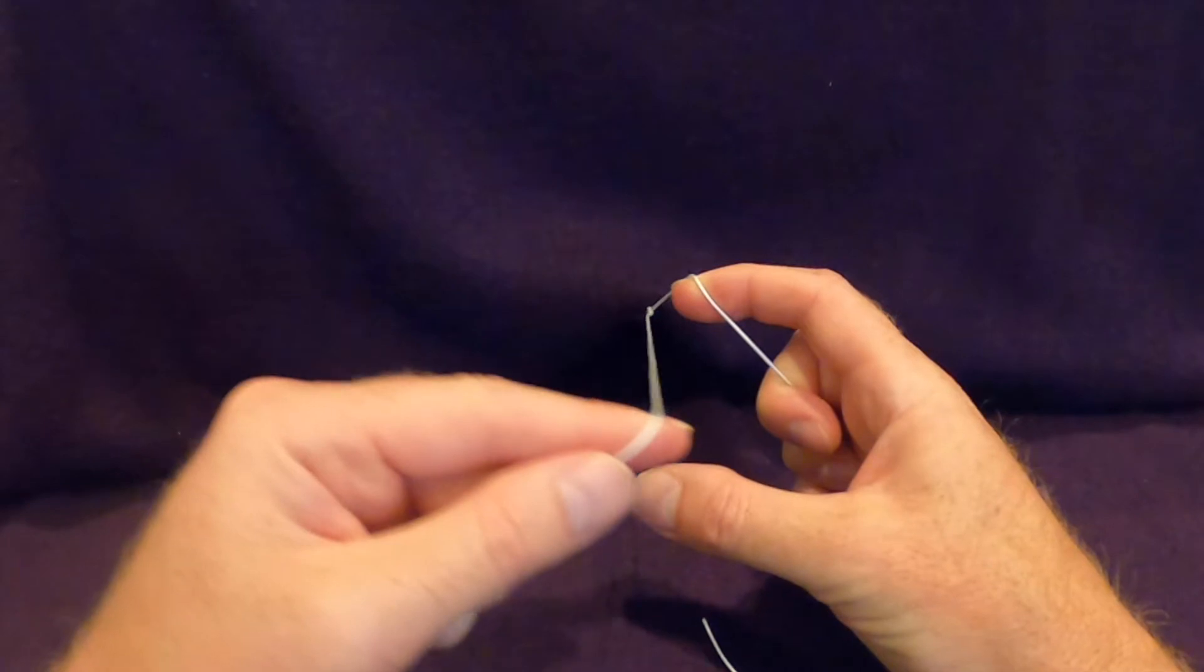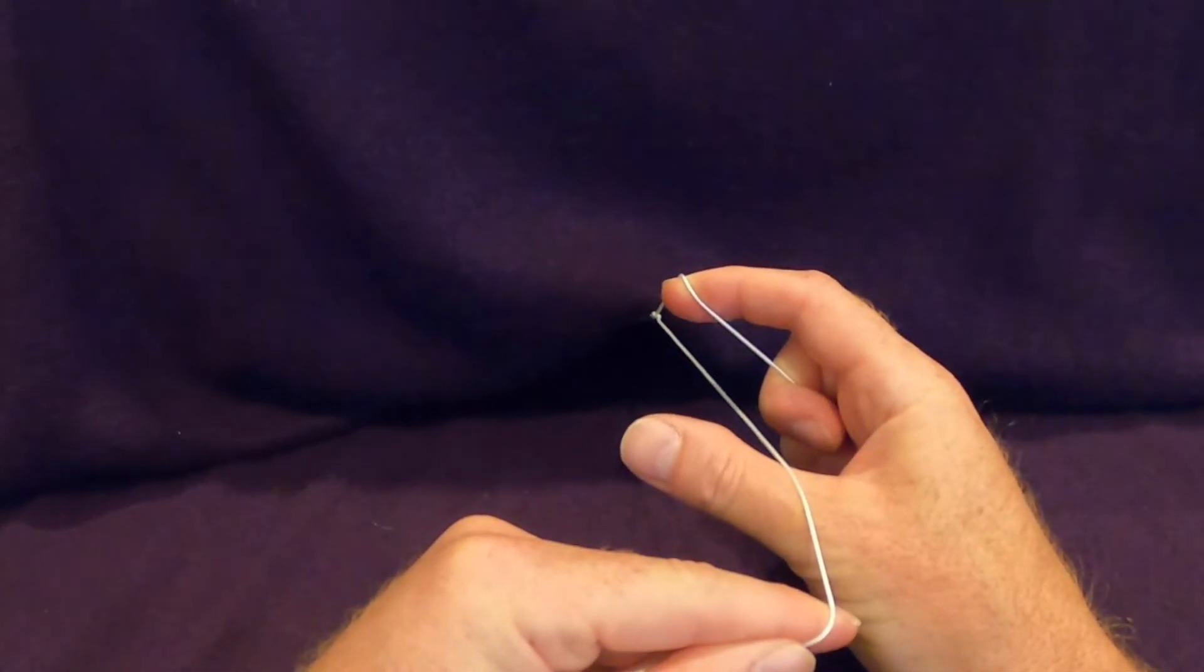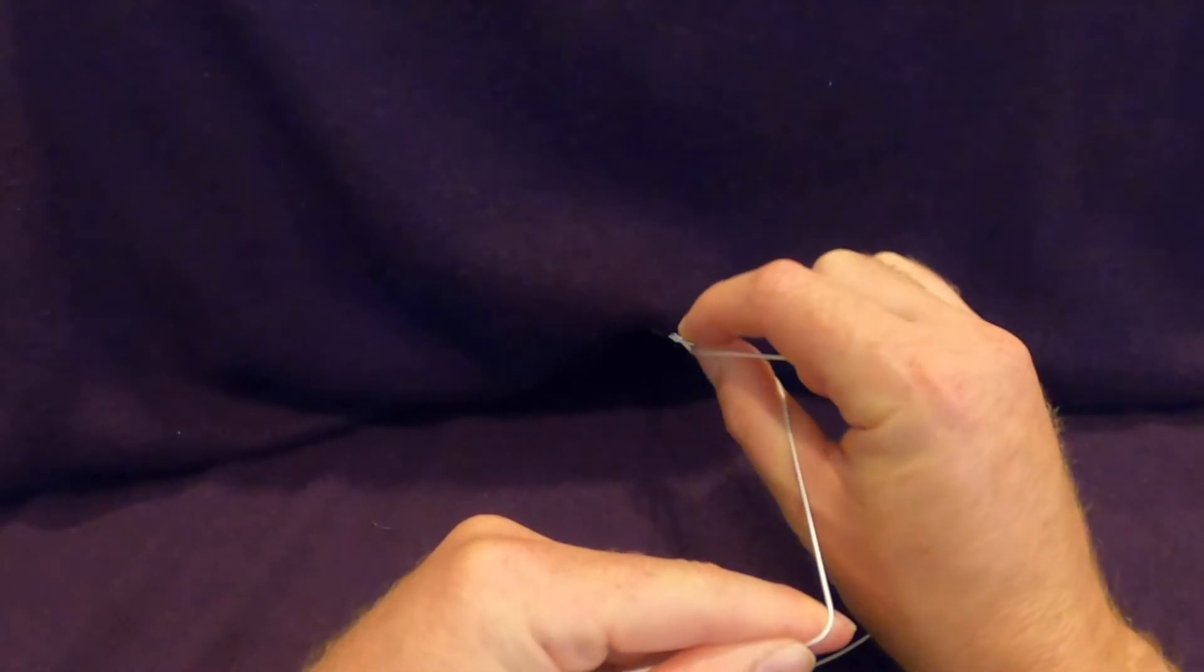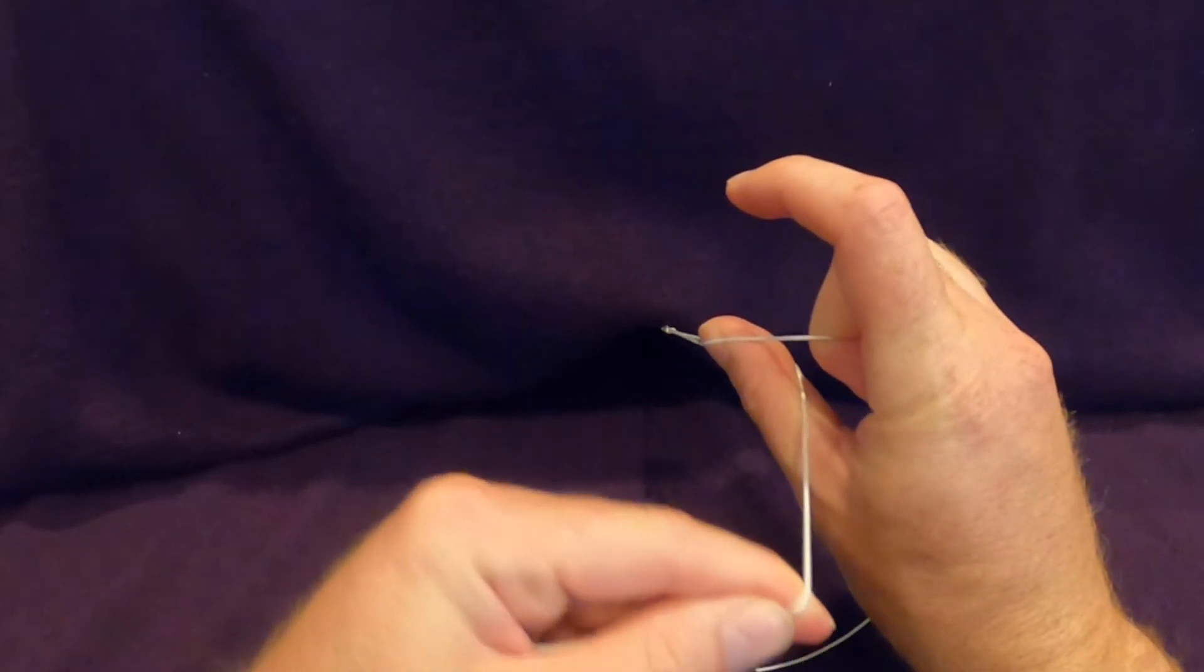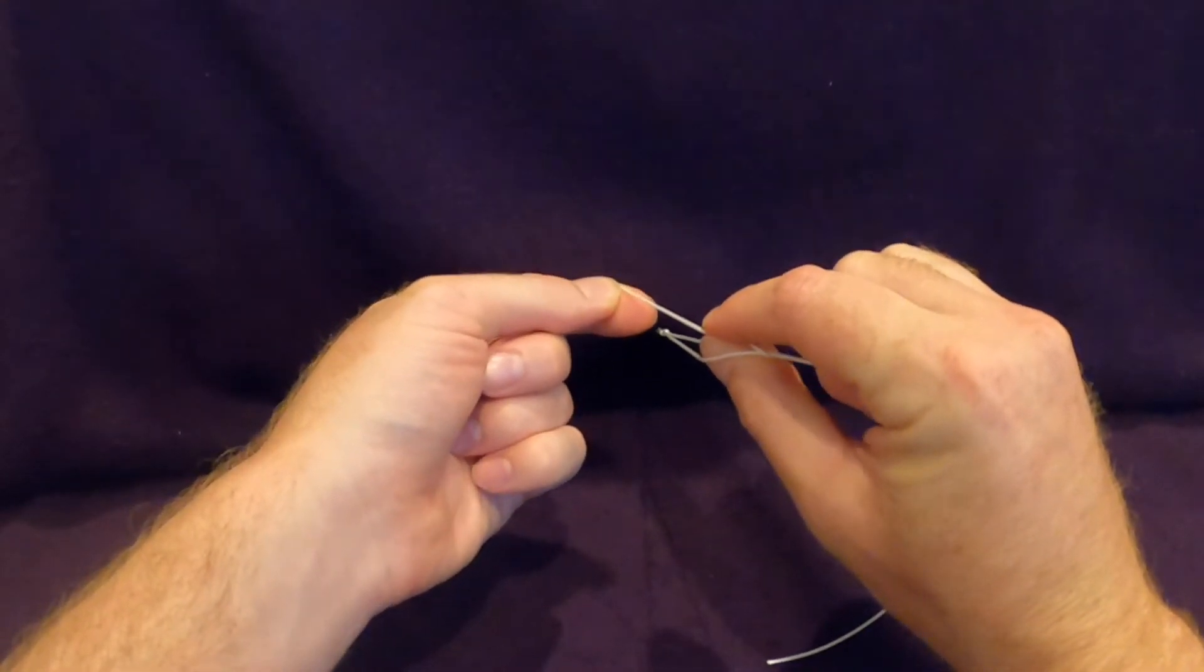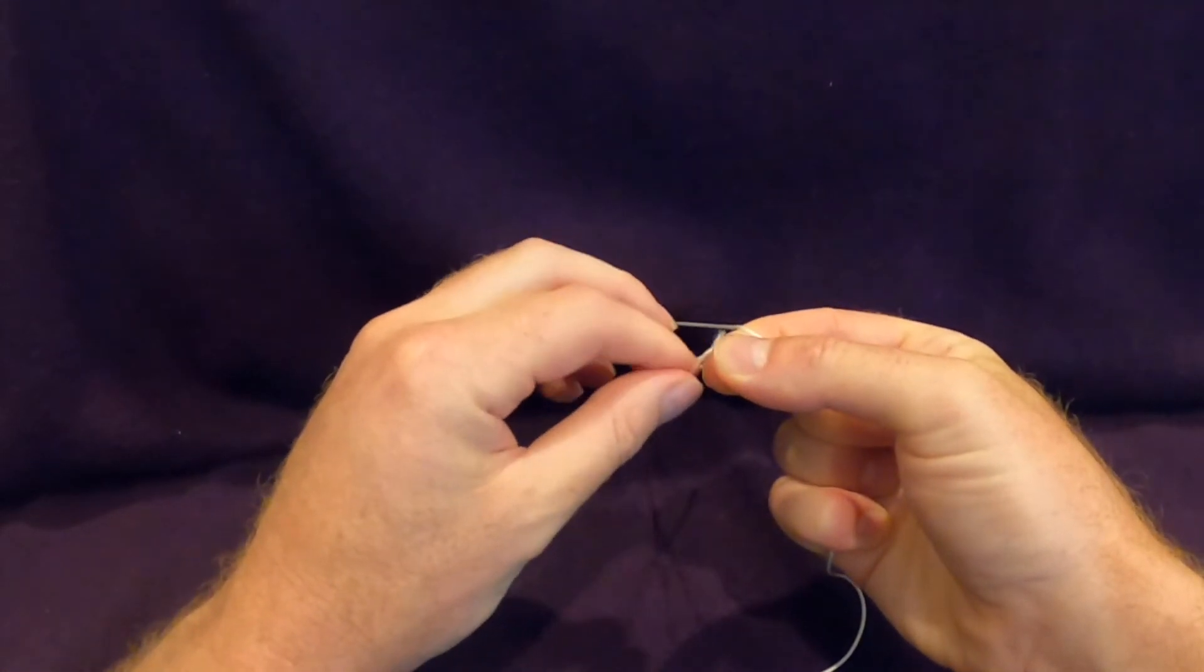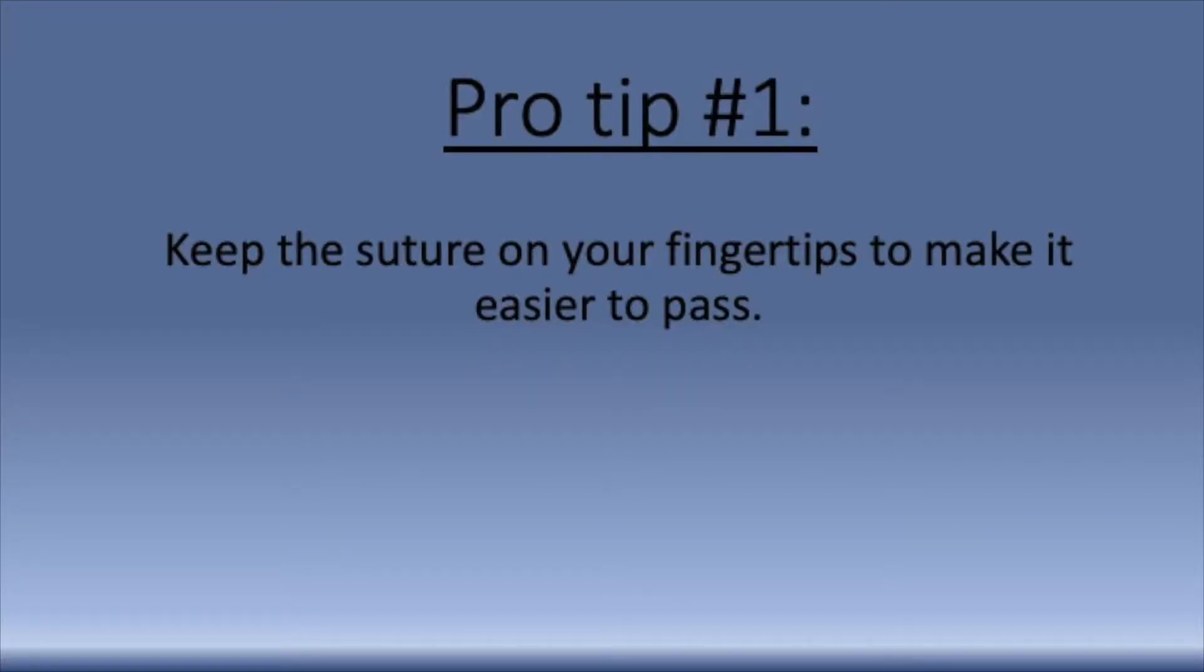Let's go through this again a little bit slower. Once again we start with a C. Watch in slow motion as the fingers close, the hand rotates, then the suture that's on the index finger will then move on to the thumb. The fingers open and this allows the suture to be passed once again between the thumb and index finger. As the fingers rotate, the tail is passed through the loop and the knot can be cinched down. Keeping the suture on your fingertips will make it easier to pass through the loops.